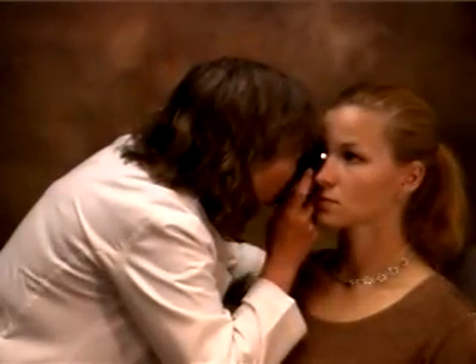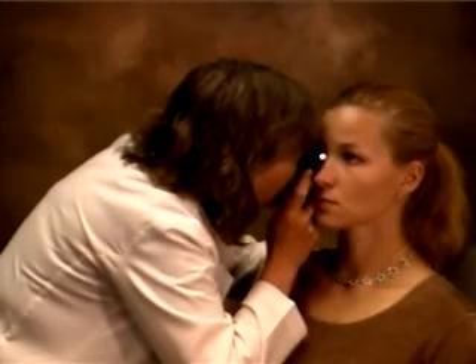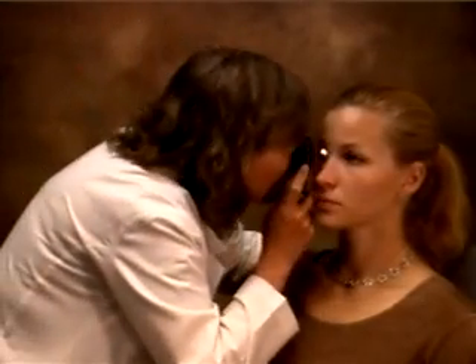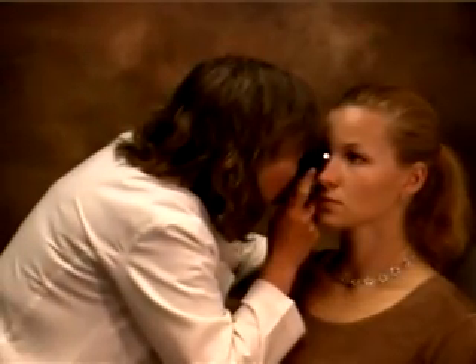I'm going to come in, and as I come in, I'm going to try to focus on the red reflex. I'm going to look at her optic disc. I have to be close enough to see through a small undilated pupil. I rest my third finger on her cheek, and this allows me to get as close as I need to.